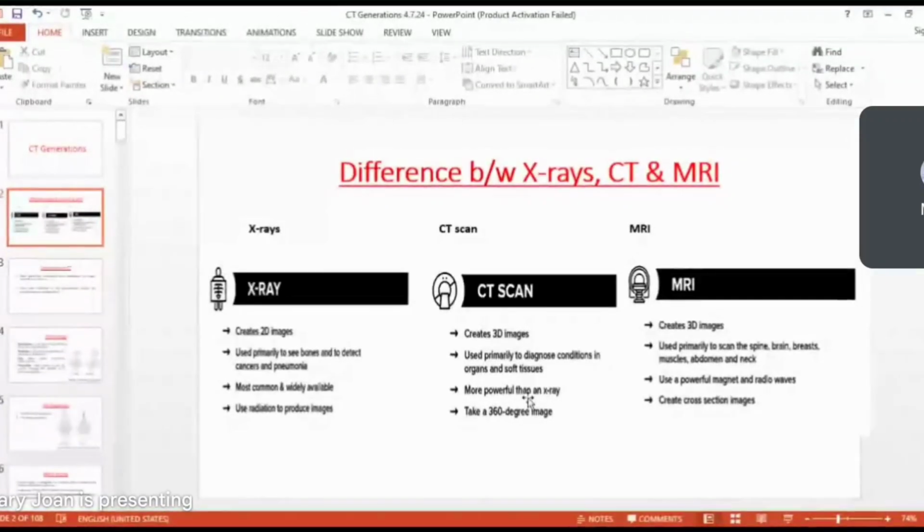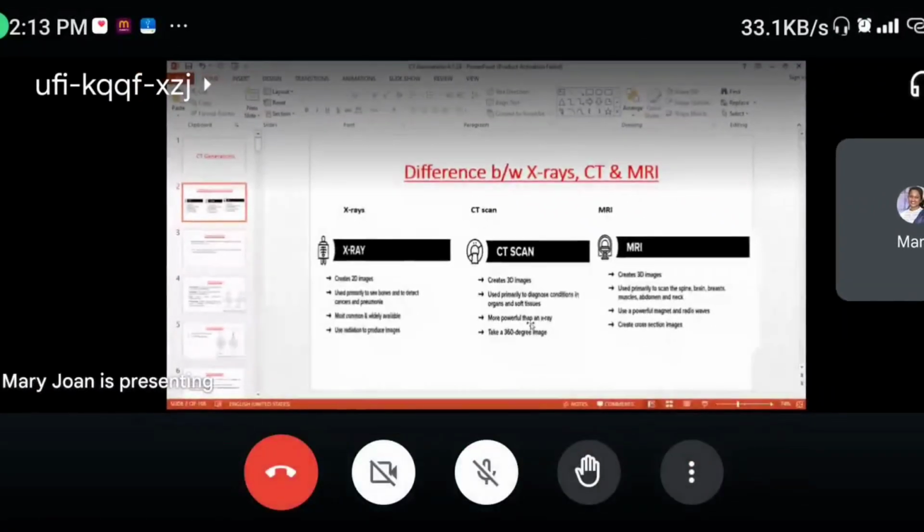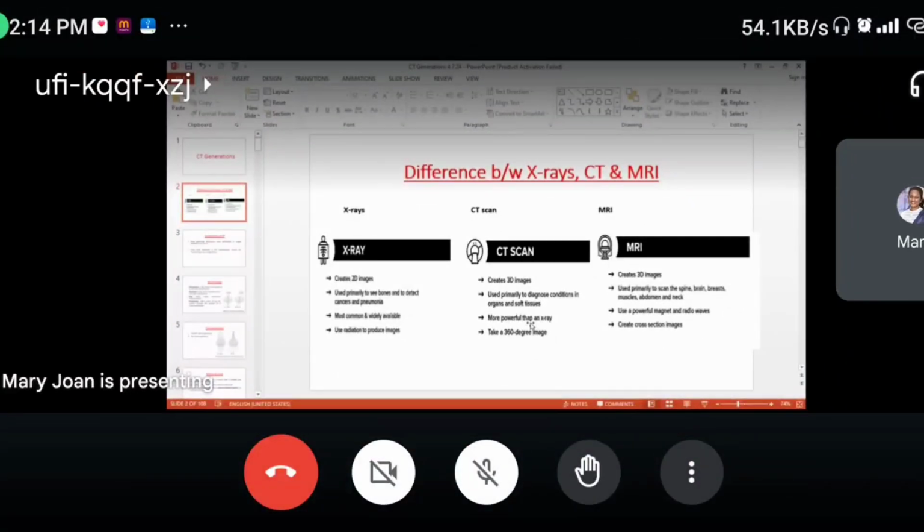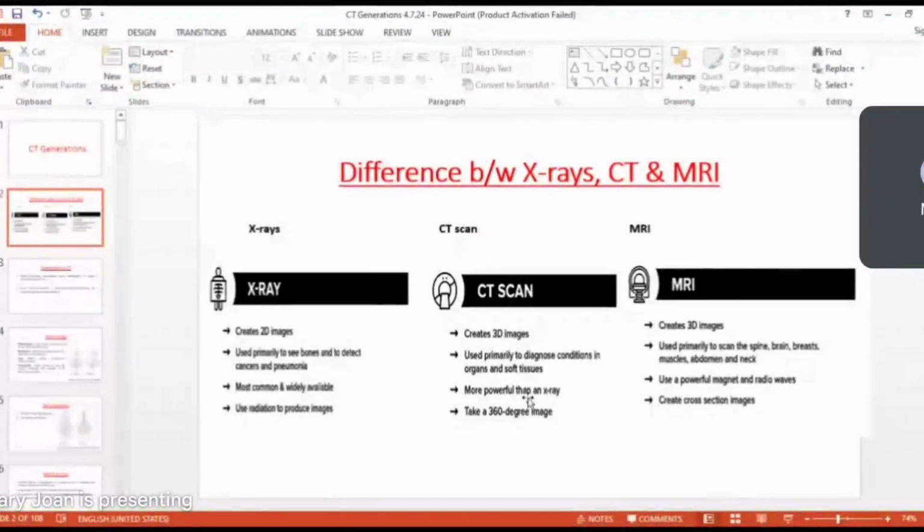So the maximum potential possible with a CT scan is also around 150 kVp only. But that need not be the exposure condition. If we have selected procedures for which we have selected kVp and mAs, then it can be lesser. If we see that we are getting a good image with lesser kVp and mAs, then we don't need to go higher, since increasing the potential adds to the radiation dose. So that is not the power.